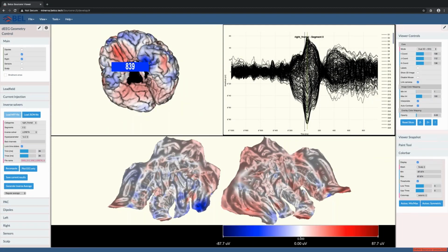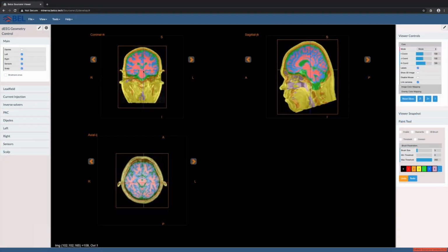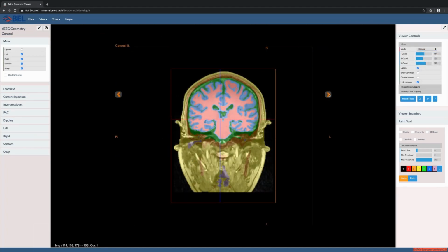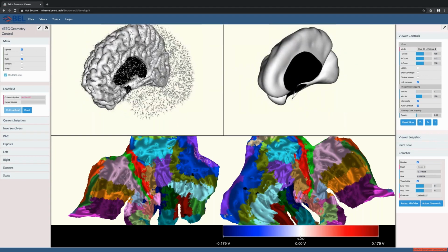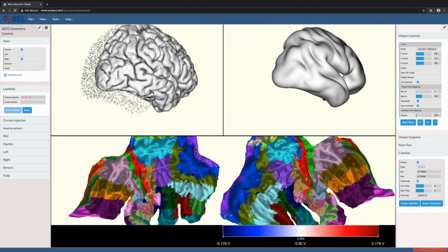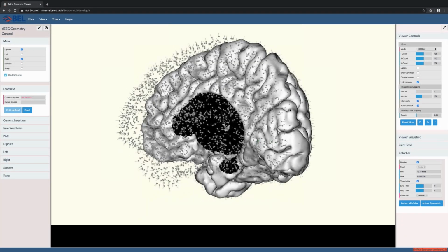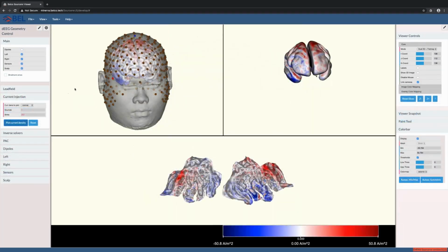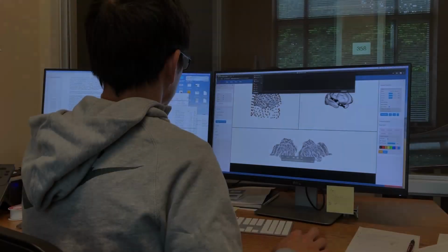We can also look at frequency localization that would be appropriate for epilepsy, or many other applications where we want to see the brain's oscillations. Sourcerer includes other visualization tools: the flat map with Brodmann areas outlined, segmentation views, source localization views, phase amplitude coupling view of an imported file, and pure EEG view. In a future update of the software, Sourcerer will include TES, or transcranial electrical stimulation planning.